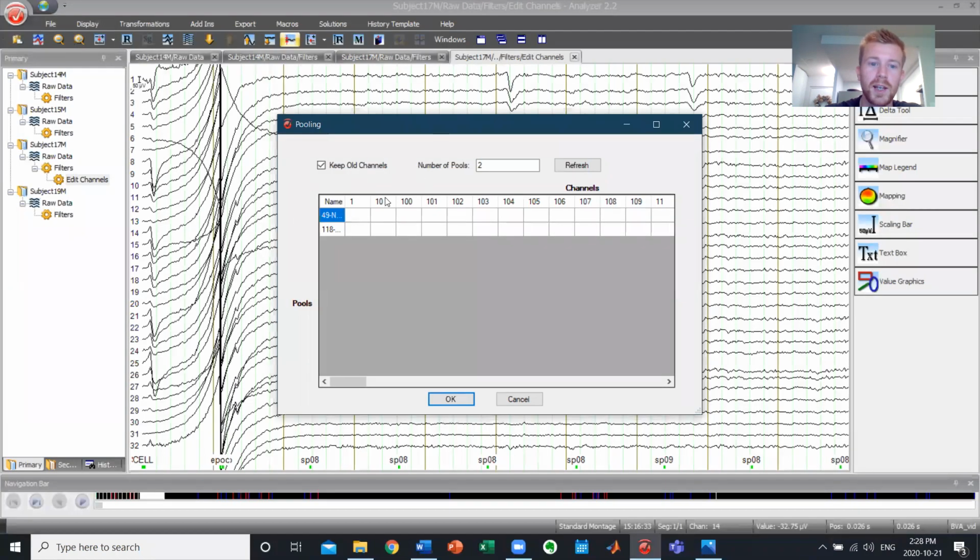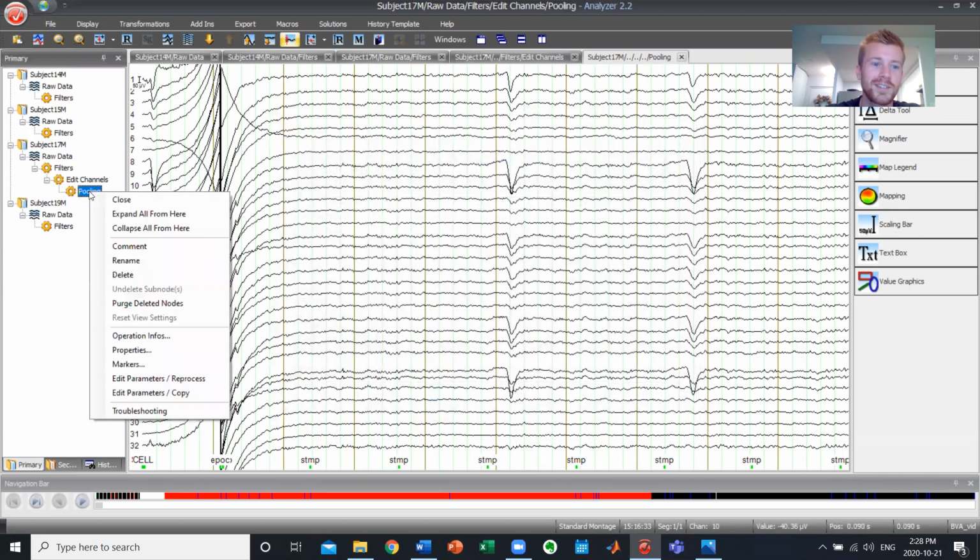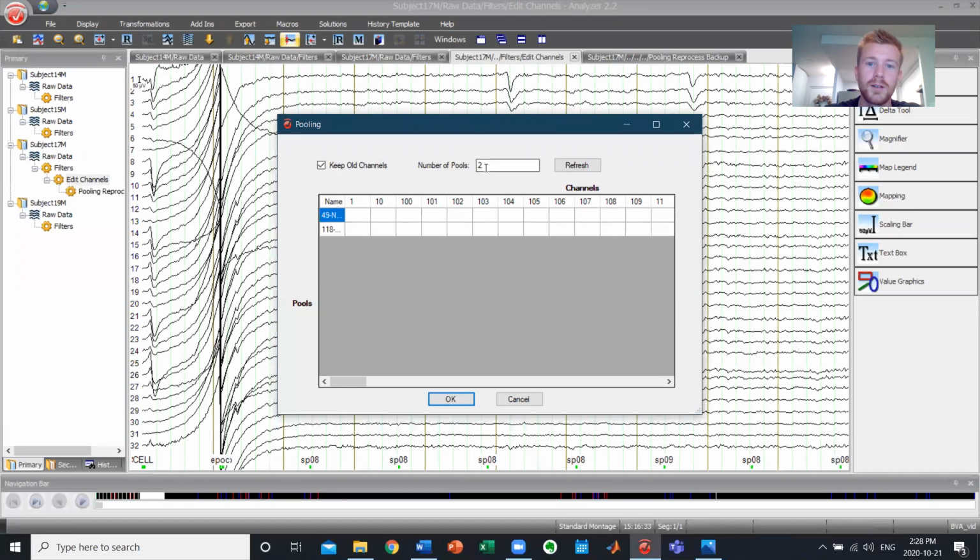So let's go back to BVA. We're going to go 49 new, 44, 45, and 46. Now you'll see that there are already channels here. When you open this up, I've already done this. When you open this up, there will be nothing, and you'll want to tell it how many pools you want. So let's say 3. Edit parameters. Let's say I want 3. Then I'll have a new one here.